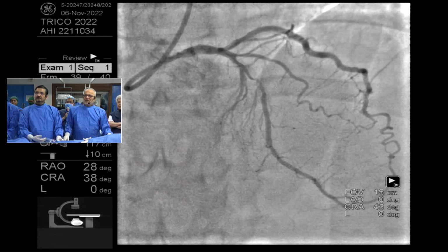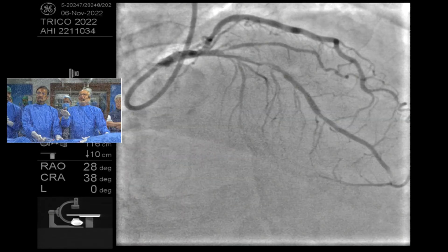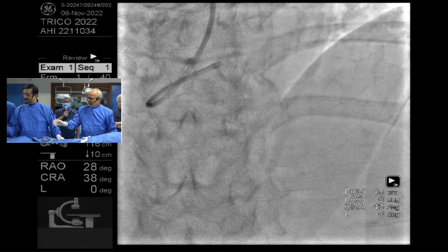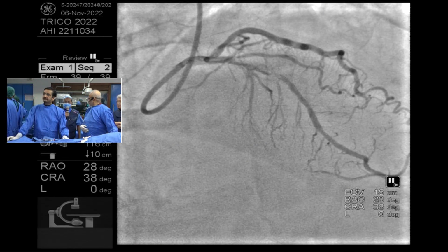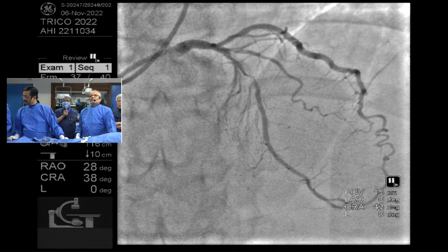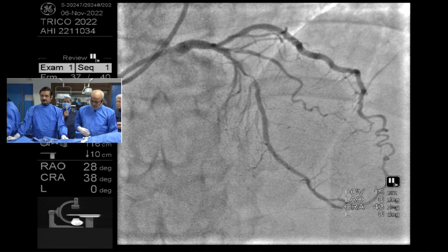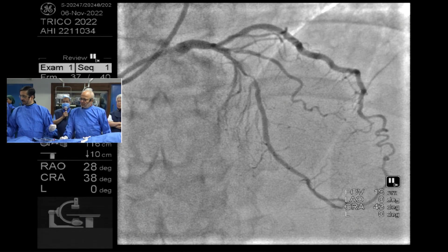For the wire, Tejas, are you going to go with Rota wire, a front or a micro catheter? I think this is the case. Despite my experience doing so many Rota, I will use micro catheter and the extra floppy run through wire. Run through with micro. Give me fine cross and run through. Besides that, those who are younger, those who have just started or will start, they will have to know that it is wise to cross the Rota wire with a microcatheter. Because Rota wire is an uncoated stainless steel wire and you don't get a good torque.